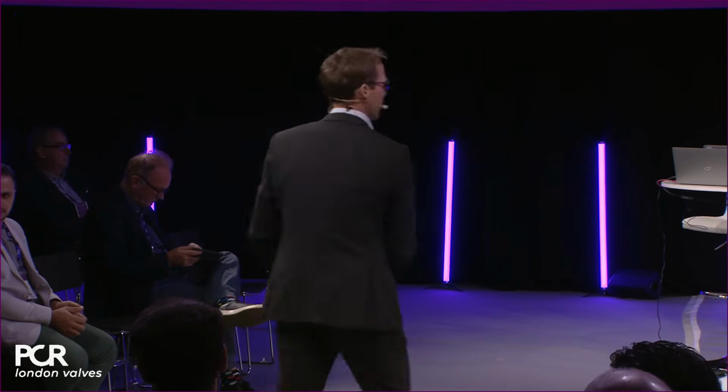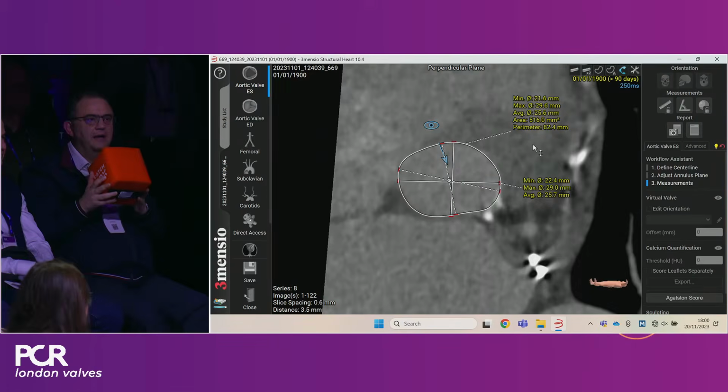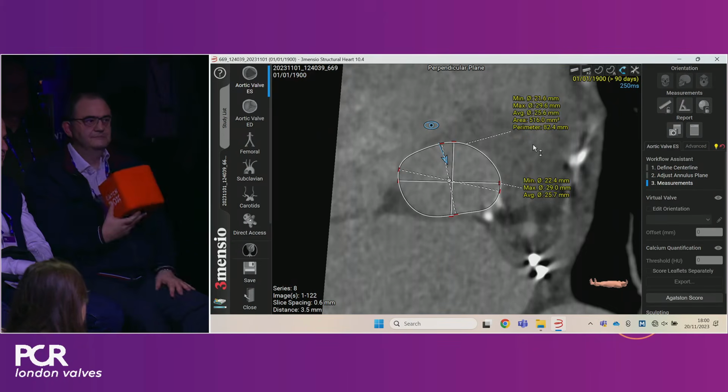Thank you. In this particular case, I agree that either valve may work. What I personally would do is an angiogram with a 23 balloon, in the view, maybe 23 plus a little bit, and if there's no leak after the aortogram, I would probably choose 29. So balloon sizing helps you a little bit.